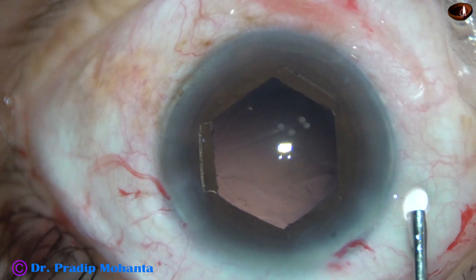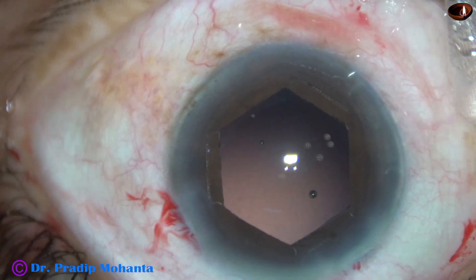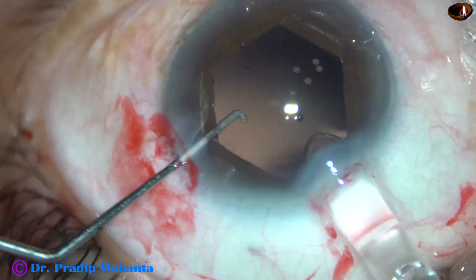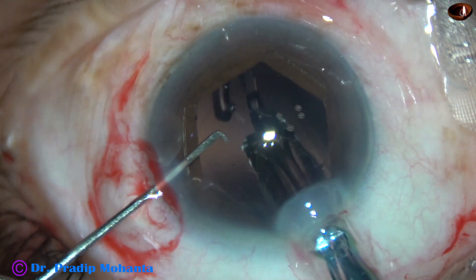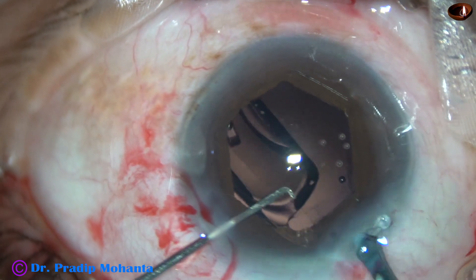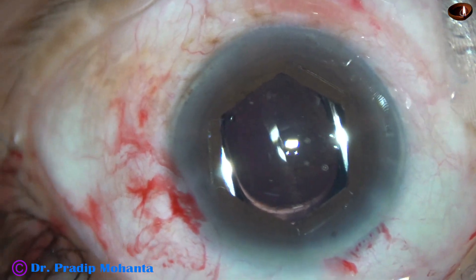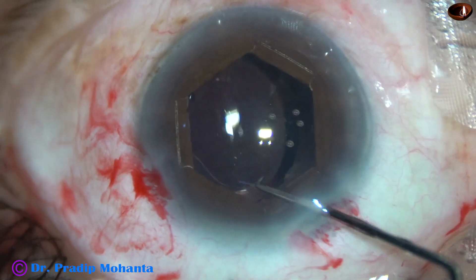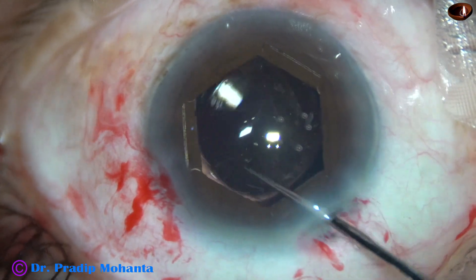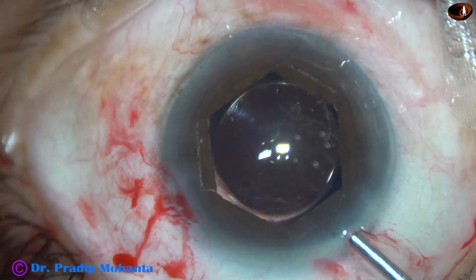Viscoelastic is used to fill the anterior chamber and the capsular bag. This is a beautiful lens — this is Sensor 1. The intraocular lens has gone into the capsular bag.